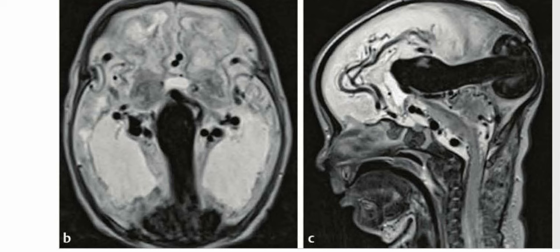On the axial and sagittal T2 MRI images, we can see that there is a large vascular malformation in the region of the vein of Galen, as well as numerous additional enlarged cerebral vessels. The malformation drains into the superior sagittal sinus via a persistent falcine sinus. There is ventriculomegaly with parenchymal volume loss. The sagittal image shows enlargement of the cervical cord and volume loss within the brainstem.